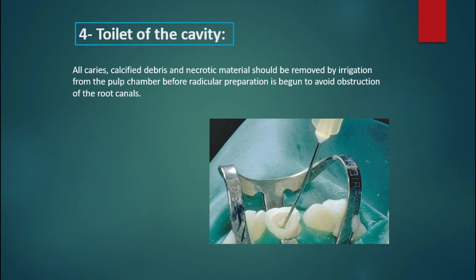The soft debris carried from the chamber might increase the bacterial population inside the canal, and the coronal debris may also stain the crowns, especially of the anterior teeth.